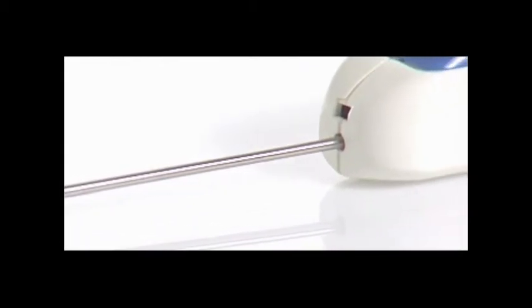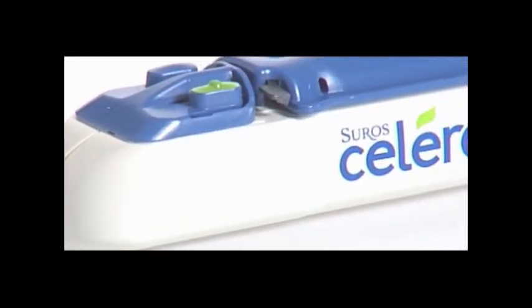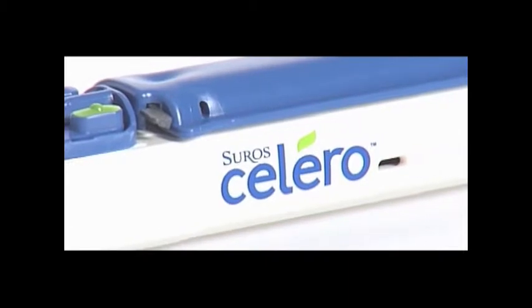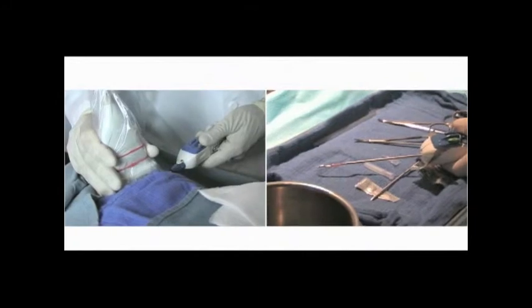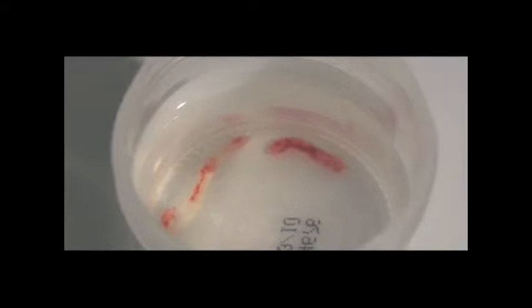The Suros Celero biopsy device is an FDA-cleared spring-loaded core device. The Celero is the first-ever fully disposable vacuum-assisted spring-loaded core device, providing better access to challenging lesions. Most clinicians are finding they require fewer tissue samples because of the larger tissue samples obtained using the Celero.